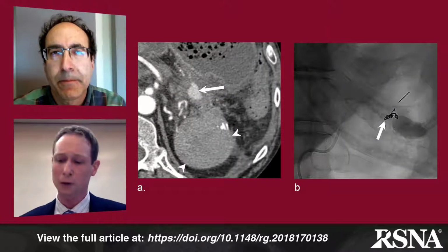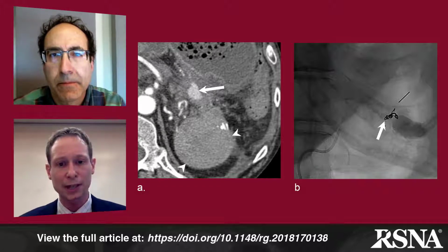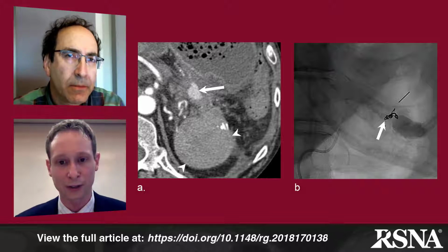And we talked a little bit about the role of CTA in figure 2, which we just discussed. But to compare CTA versus multi-phase CT enterography a little more, there are important protocol differences. When we're using CT angiography, we're using this primarily in patients who we think are actively bleeding, and that's what we're looking for, the active bleeding source.